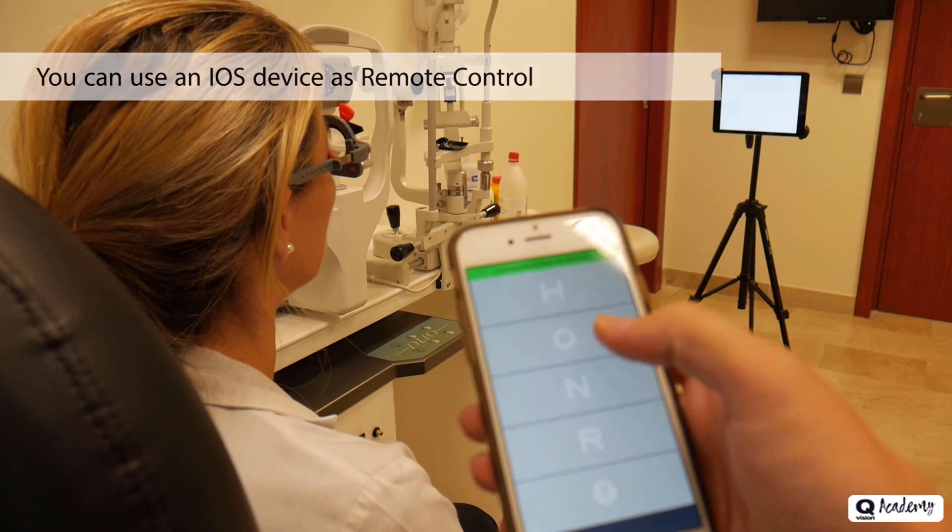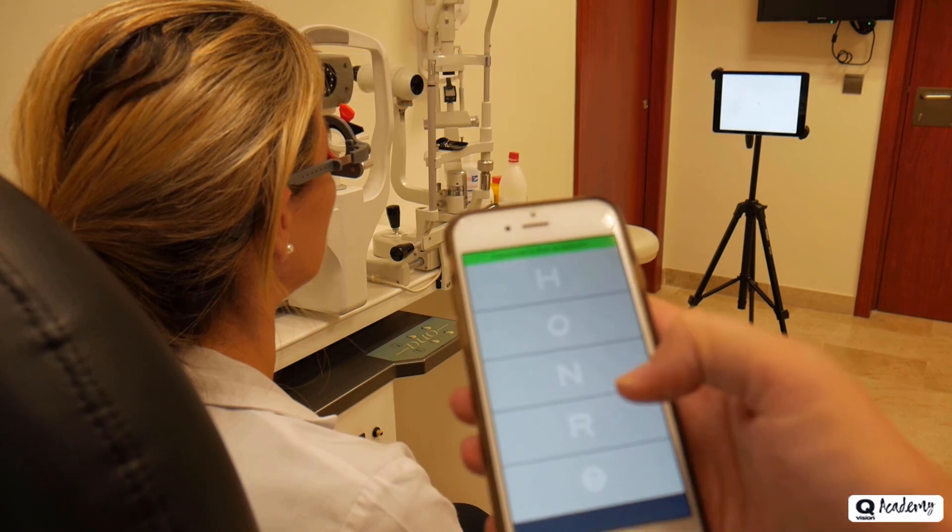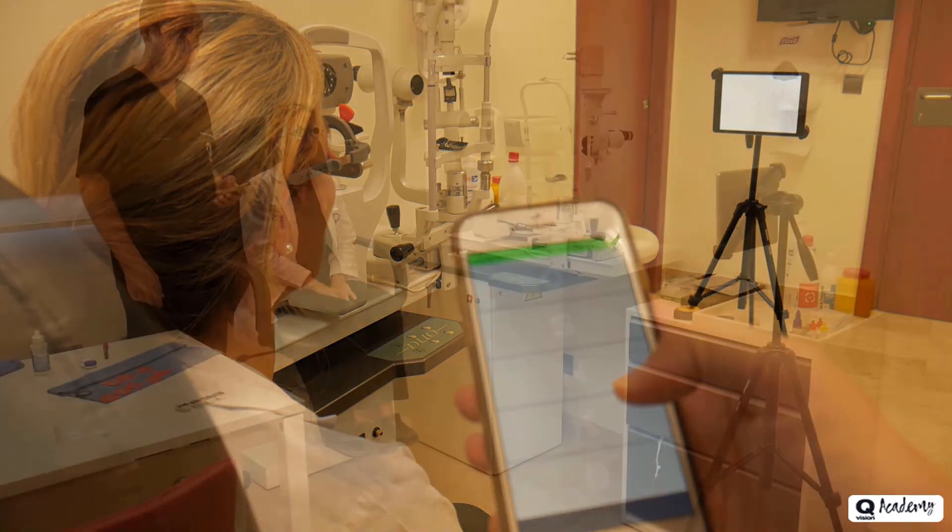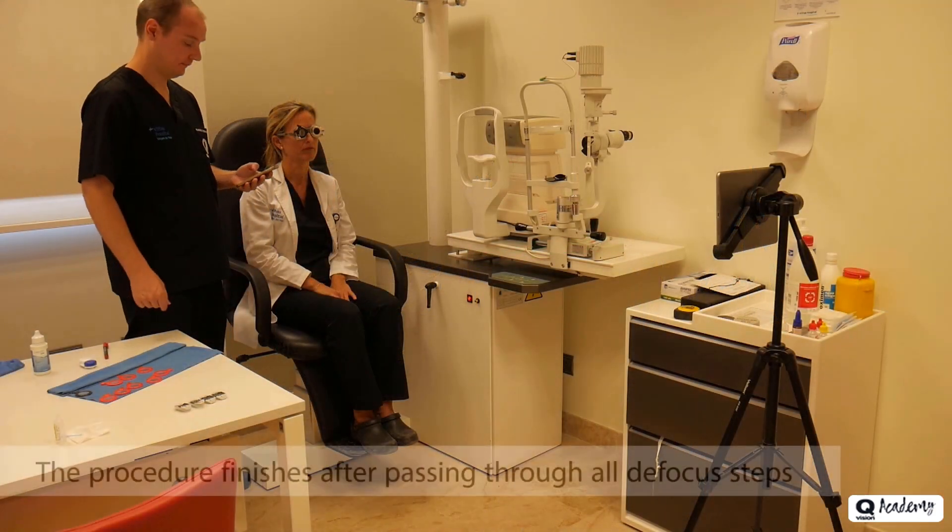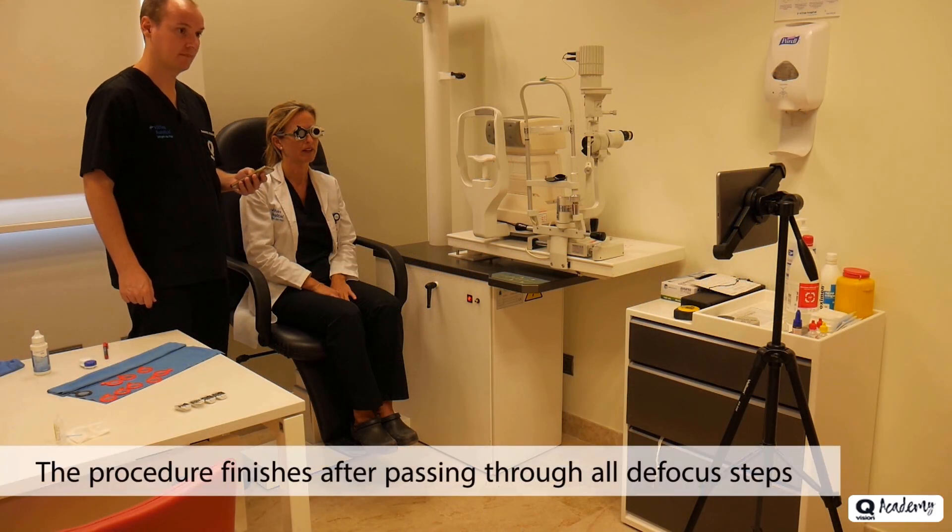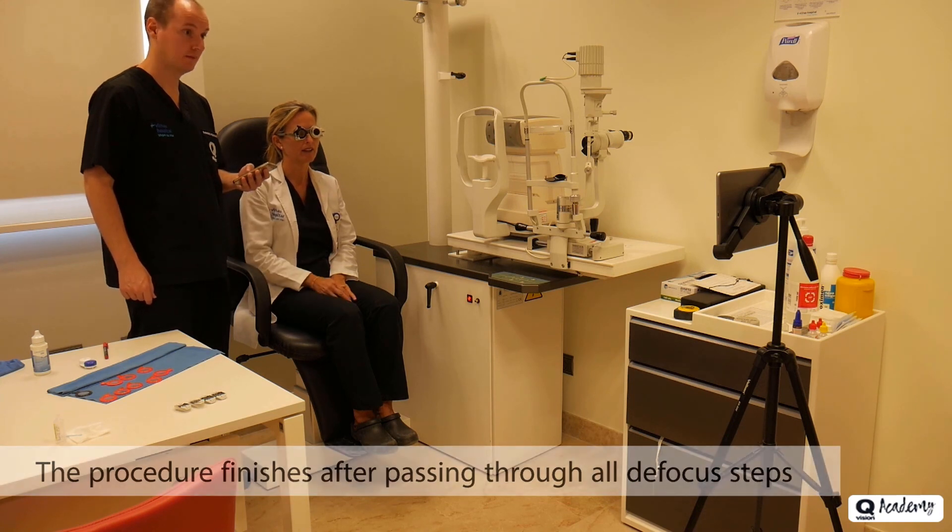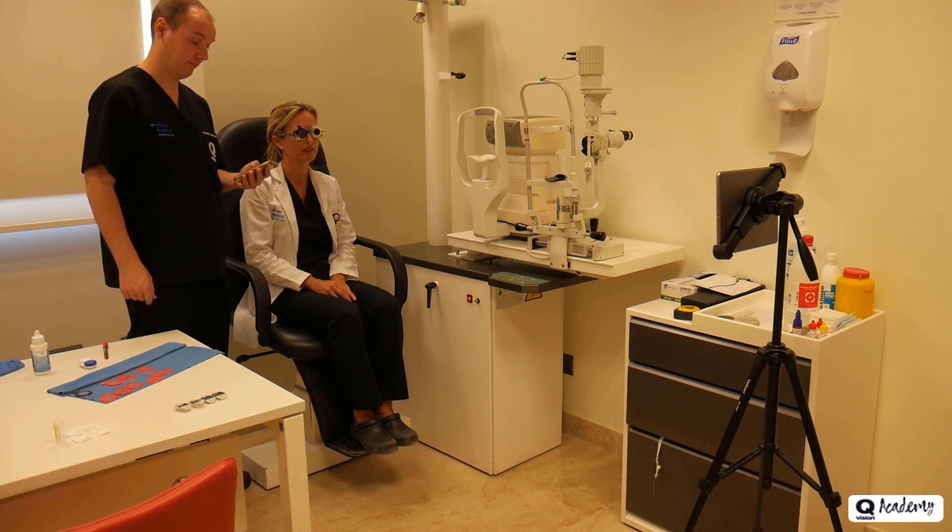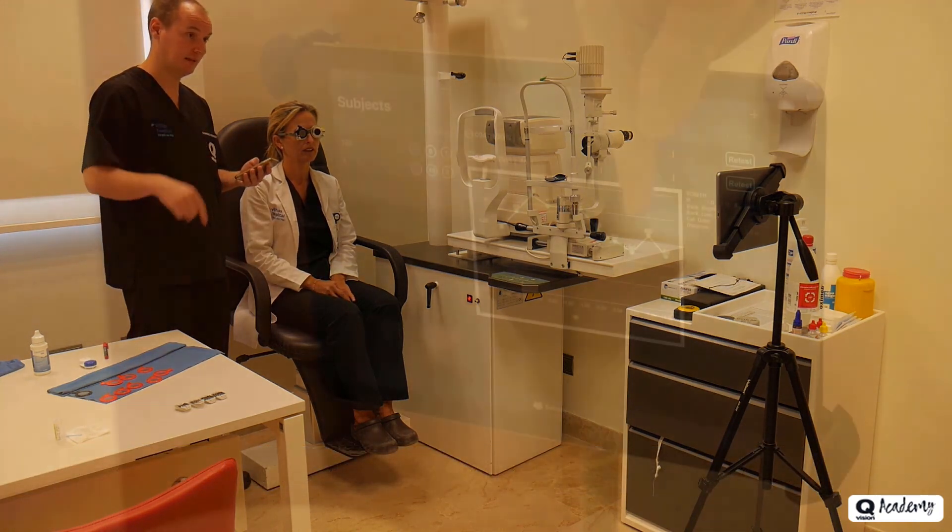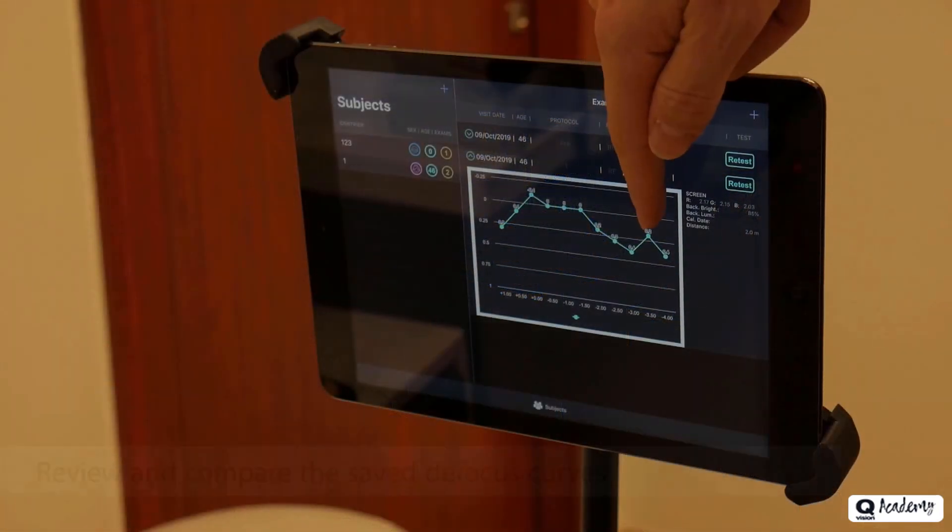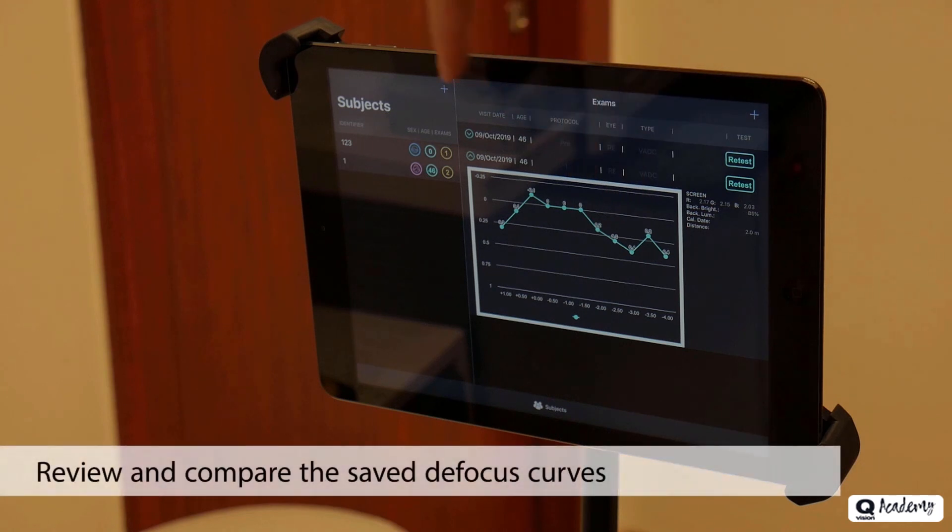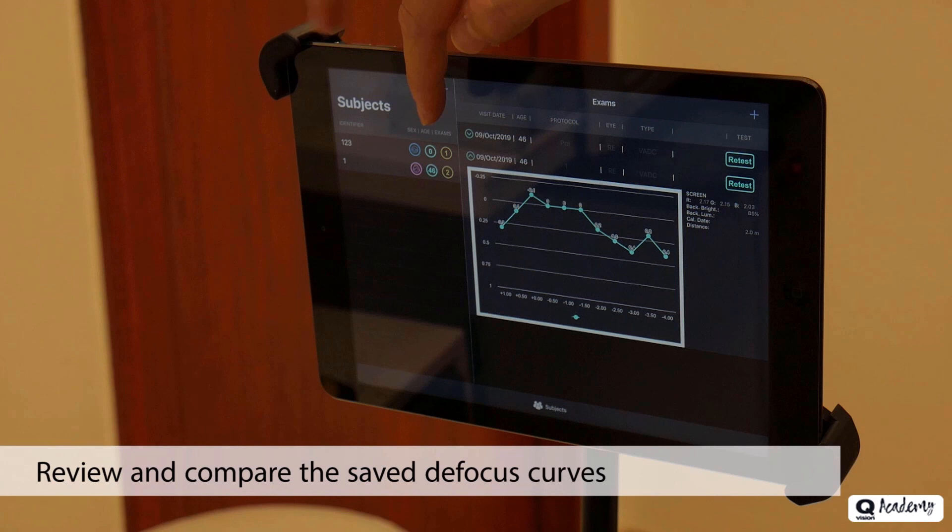If you have an iPhone or another iPad connected to the same Wi-Fi network, you can use this second device as a remote control to avoid moving the iPad to the patient, saving time during the test. Once all the possible defocuses have been run through, the procedure will end with the defocus curve appearing on the iPad screen.